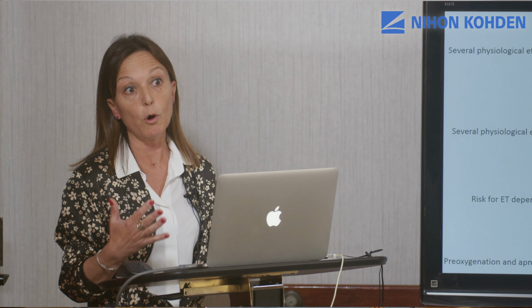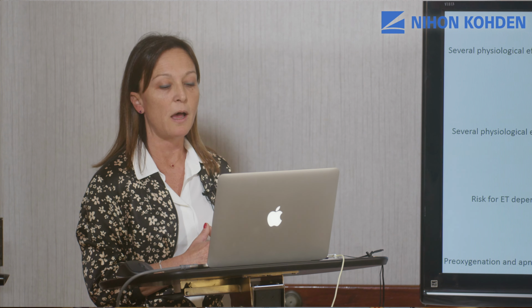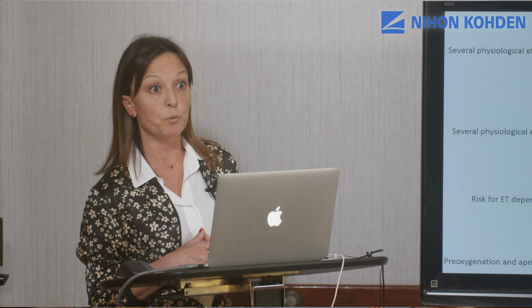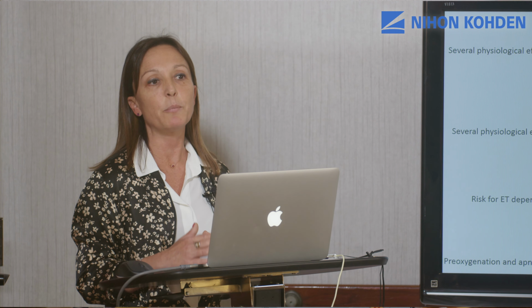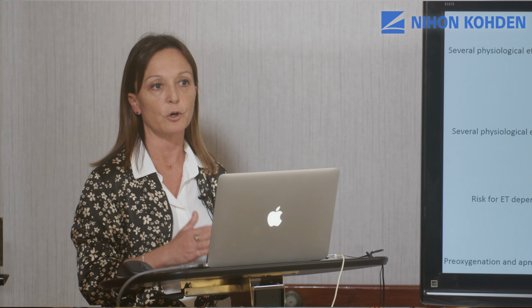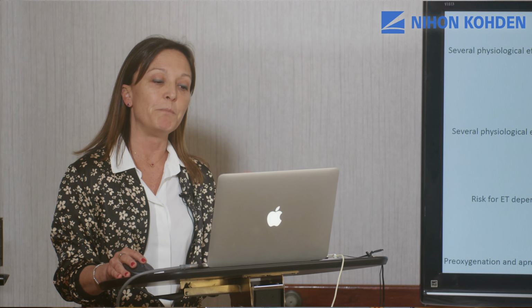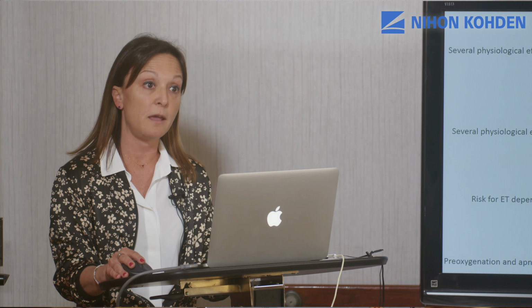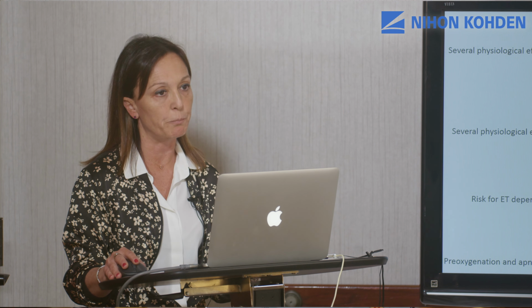And we well know that when we apply high flow nasal cannula to very severe patients with acute respiratory failure due to ARDS, it's really important to strictly monitor the patient in an ICU. And the major problem is not to delay the intubation. Never delay the intubation in the most severe patient.